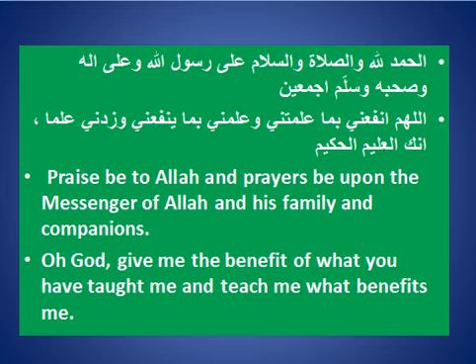My topic today is about the differential diagnosis of hypervascular focal liver lesion and clues for the diagnosis, with some examples.